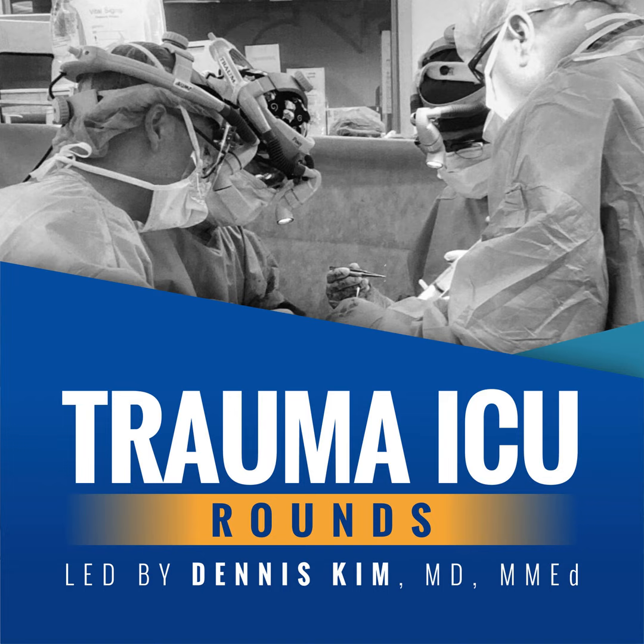But sticking with the basics, there are really three breath delivery techniques, and they are: number one, continuous mandatory ventilation; number two, synchronized intermittent mandatory ventilation; and number three, spontaneous breathing modes. So let's discuss these different modes and review when and why we might choose one over another. One caveat here is that the choice of mode in any given unit is oftentimes more of a cultural, local, or provider preference phenomenon, rather than any superiority of one mode over another.